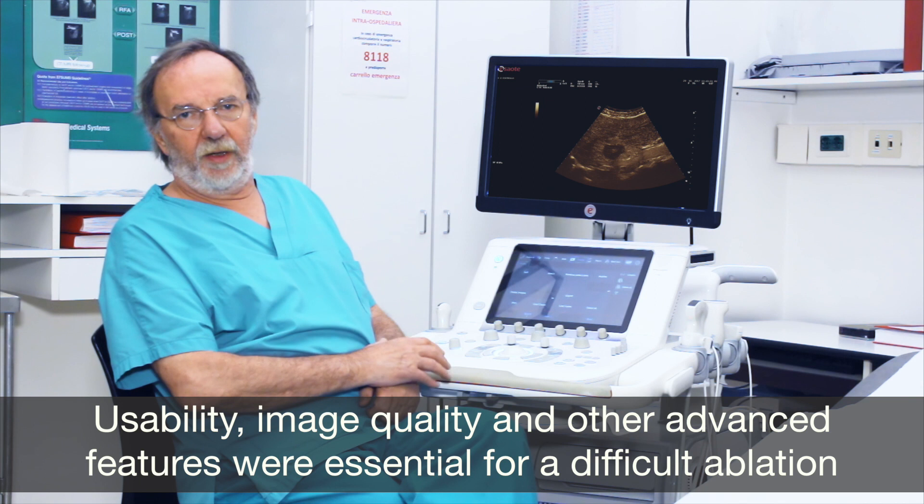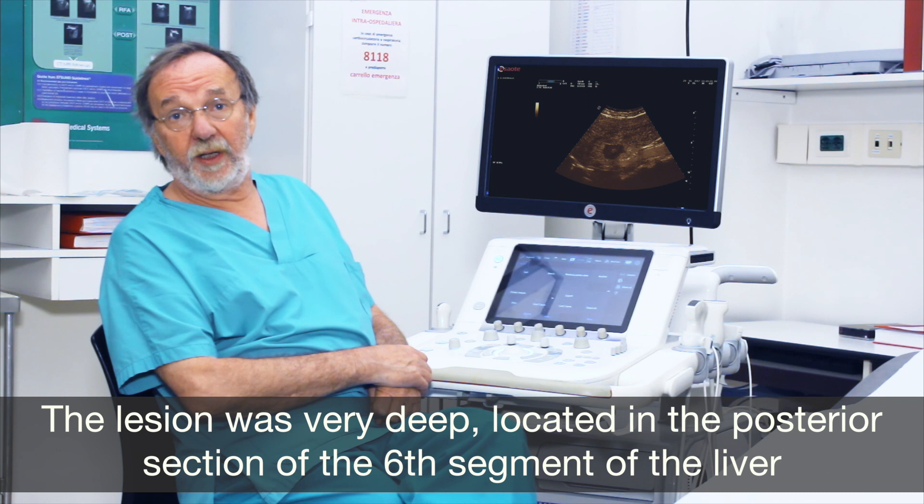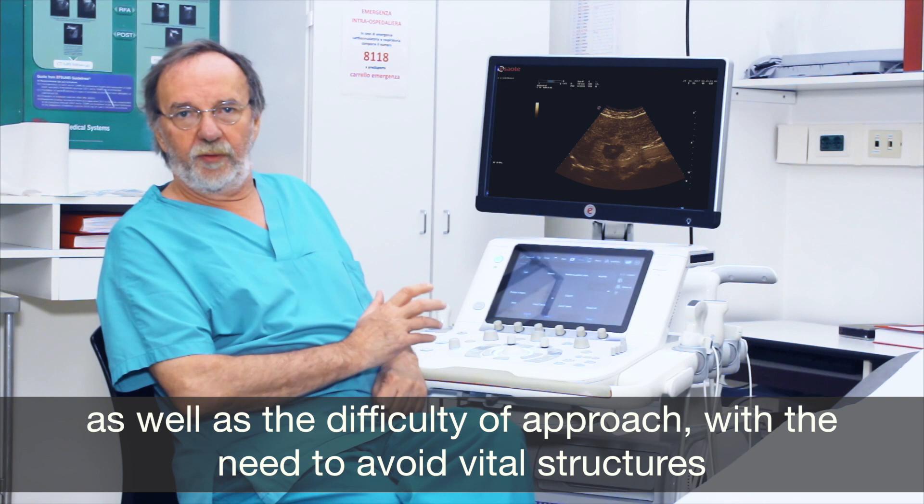Usability, image quality, and other advanced features were essential for a difficult ablation that our team performed recently. The lesion was very deep, located in the posterior section of the sixth segment of the liver. The necrosis area generated by the microwave therapy is clearly visible here, as well as the difficulty of approach with the need to avoid vital structures.